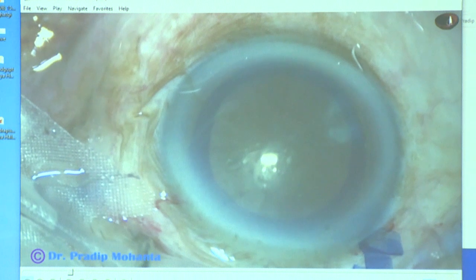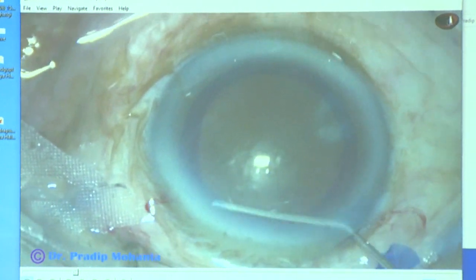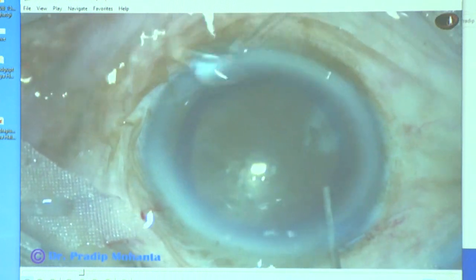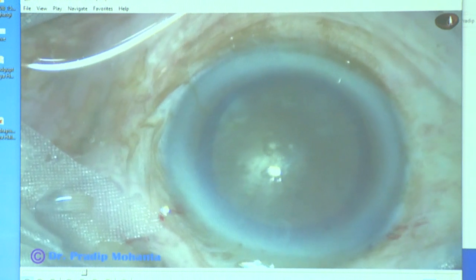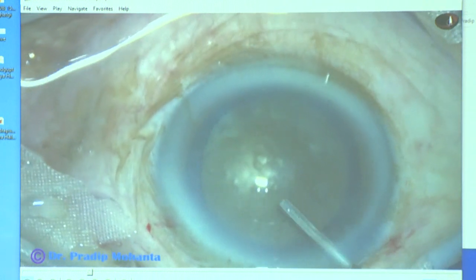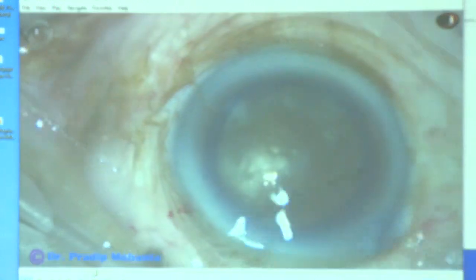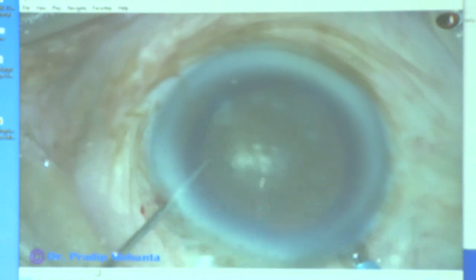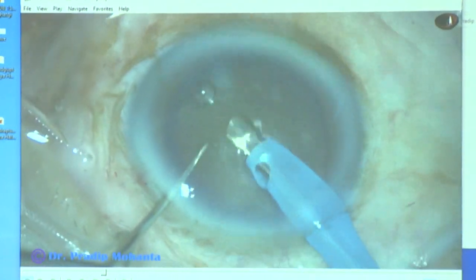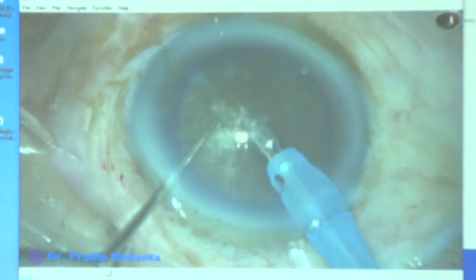And now hydrodissection is done at multiple points. Very small amounts of BSS is injected at multiple points. We cannot see the fluid wave. We can see the nucleus is lifting upward a bit. And then we mobilize the nucleus, apply visco again. In such cases, it is a better idea to do modified soft shell technique. You can use viscoat or chondroitin sulfate of any brand, and then underneath that you use HPMC. I usually manage with HPMC.